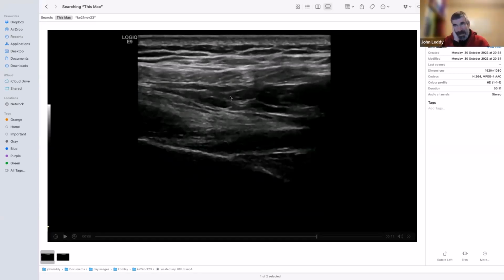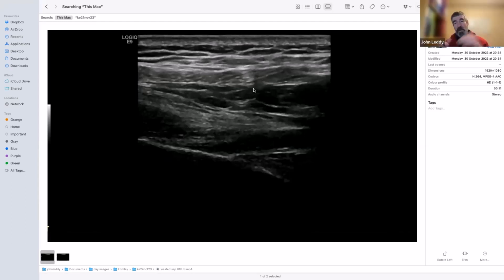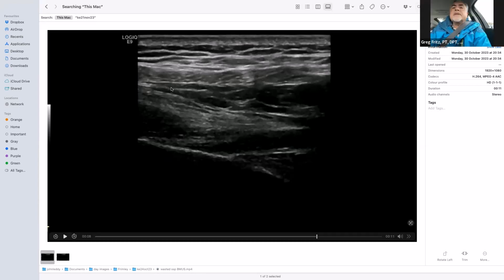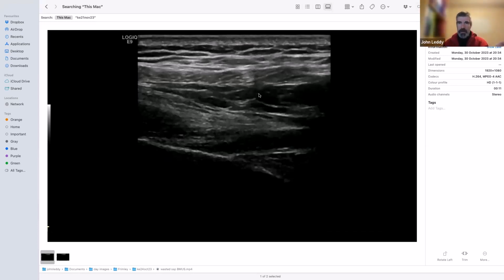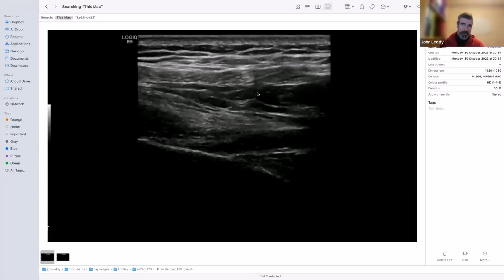Well, if you look, it's all those things. It's the direction of the fibers. It's the architecture within it. It looks lobular. The fibers are not linear. And when you change the direction of the probe, you don't get much change. In muscle it's going in one direction. It's dots, it's lines, it's dots, it's lines. You turn it 90 degrees and you go from lines into dots.